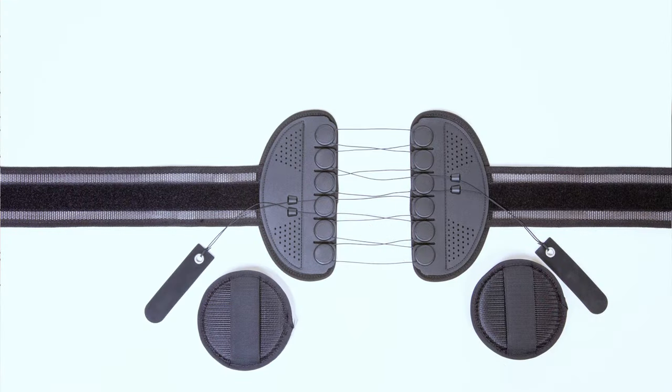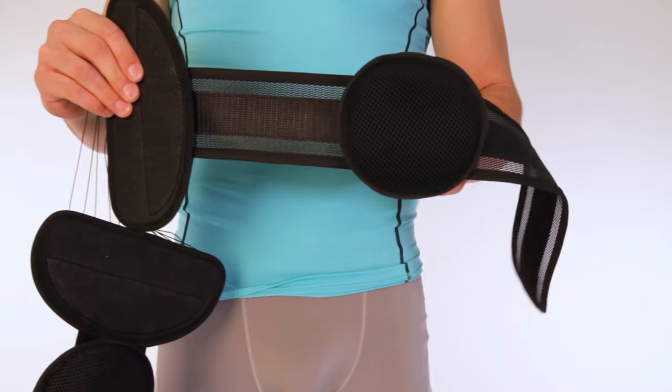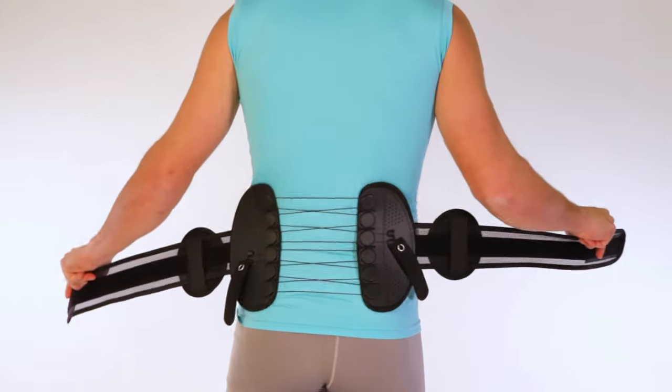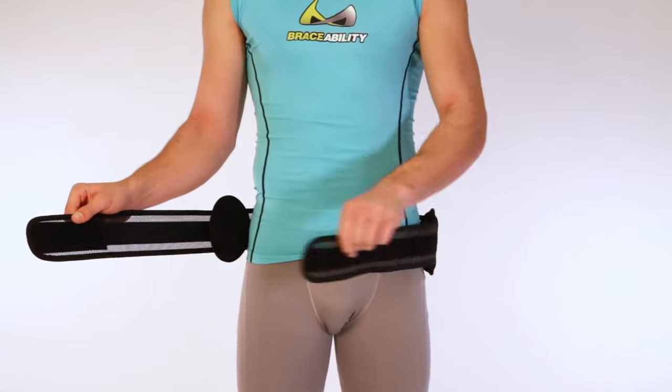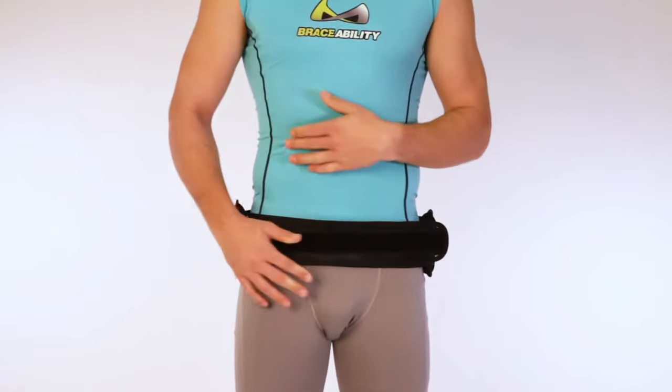How to apply: Undo fasteners, laying the brace flat to identify each part. Slide pressure pads onto each end of the belt. Attach handles on belt close to the pulley system. Standing upright, center the back panel on your lower back just above the buttocks. Wrap the left side of the belt to the front, then wrap the right side to the front and attach on the left side.